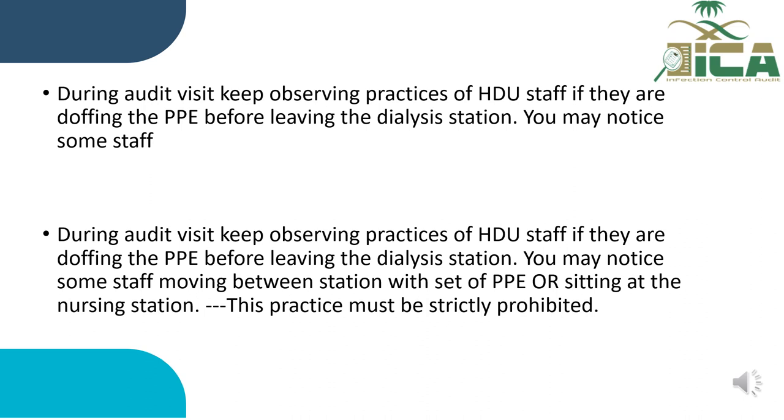During the audit visit, keep observing the practice of hemodialysis unit staff, if they are doffing the PPE before leaving the dialysis station. You may notice some staff moving between stations with a set of PPE or sitting at the nursing station. This practice must be strictly prohibited.